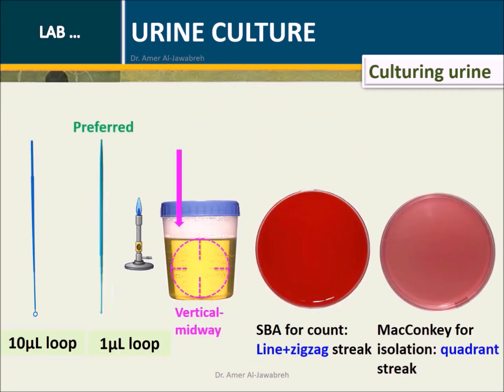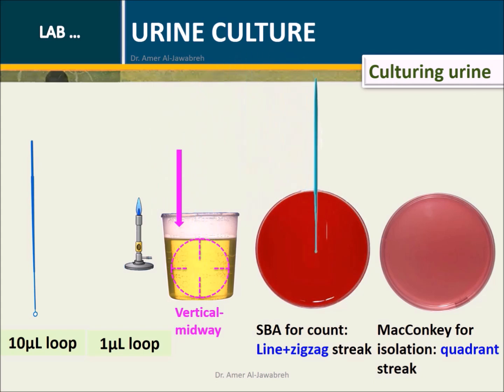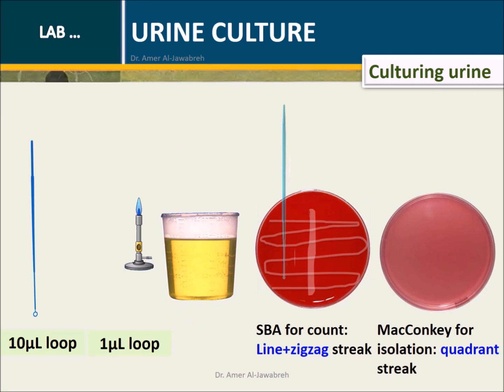Insert one microliter loop vertically and midway into the urine sample. Streak line plus zigzag on SBA for count. Repeat on MacConkey agar with quadrant streaking for isolation.